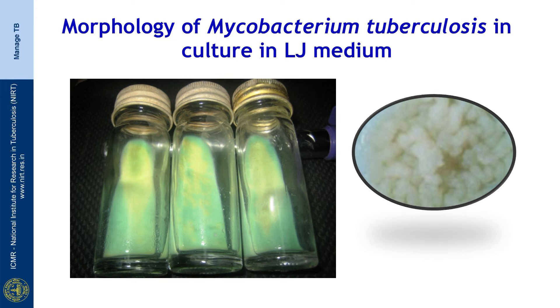This is how the organism appears in culture on the LJ medium. Typically, or characteristically, it is called rough, buff, and tough. It is tough to emulsify, it is buff in colour or a dirty cream colour, and it is rough in texture.